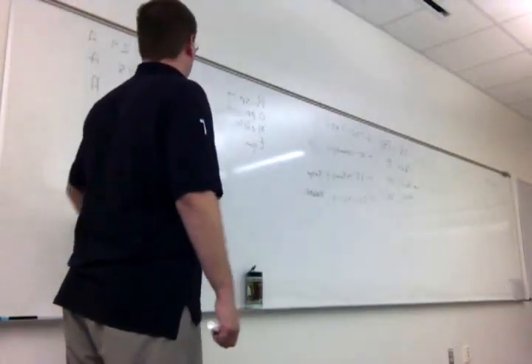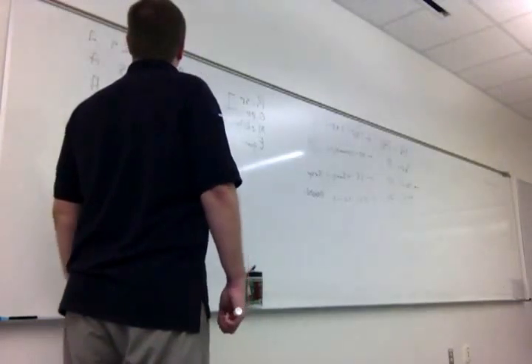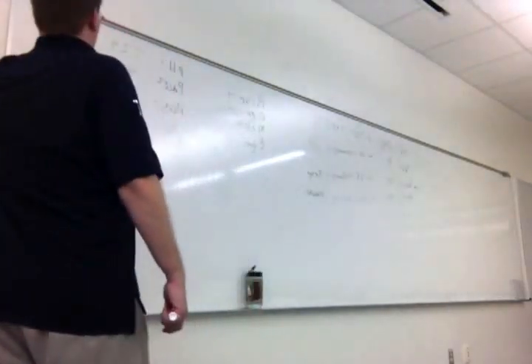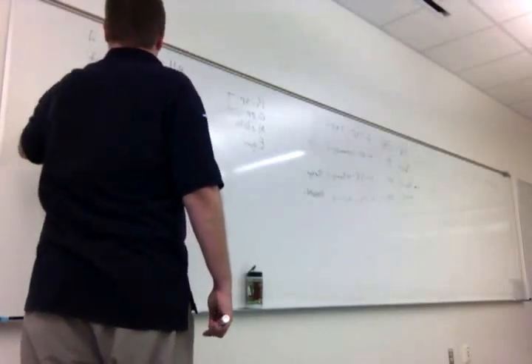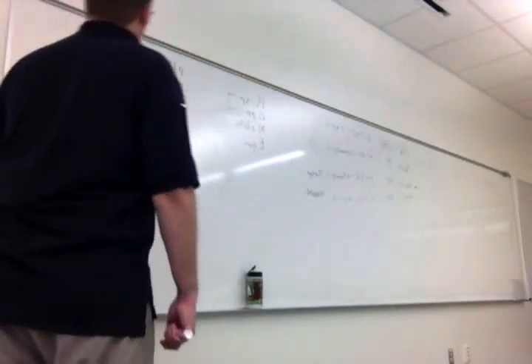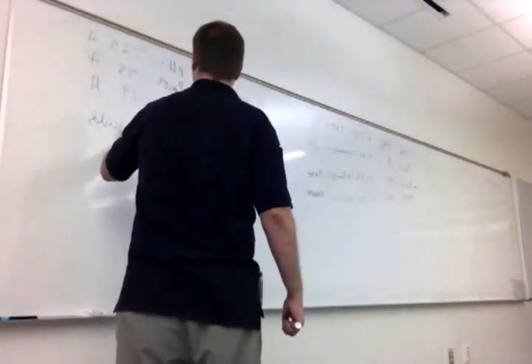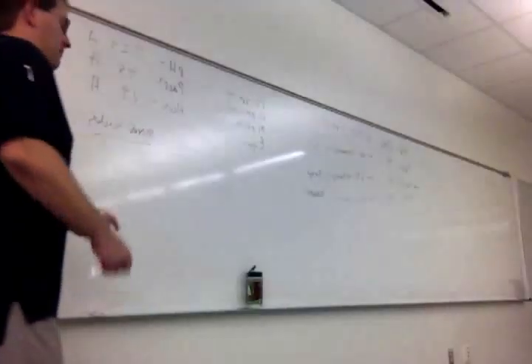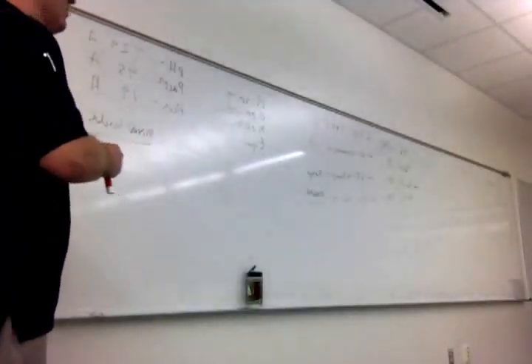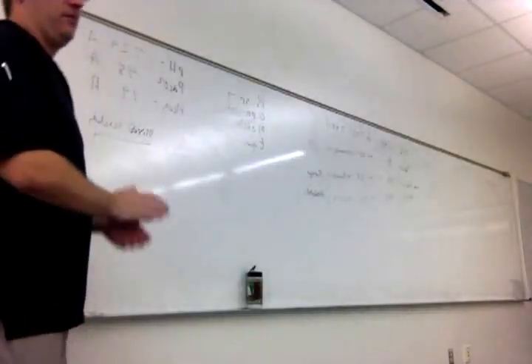Uncompensated. Uncompensated, respiratory, metabolic. Okay, so connect the dots. Is it an acidosis? Yes, so it's an acidosis. What do we call it when it's both a respiratory and a metabolic? Mixed. We call that a mixed acidosis. That's not good. Mixed acidosis is generally not a good deal at all. All right, does that help out a little bit with ABGs? That's really all there is to it.